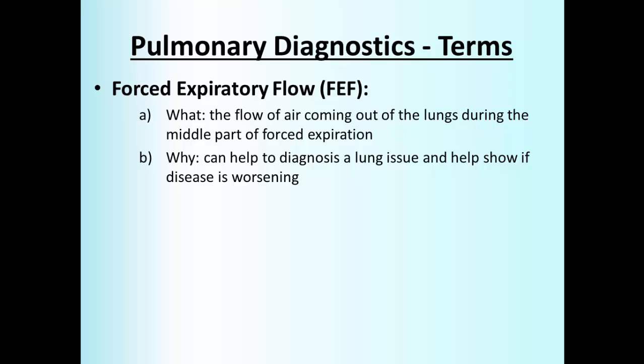Forced expiratory flow is the flow or speed of air coming out of the lung during the middle portion of a forced expiration. We look at this because it can help to diagnose a lung issue and help show if the disease is worsening.